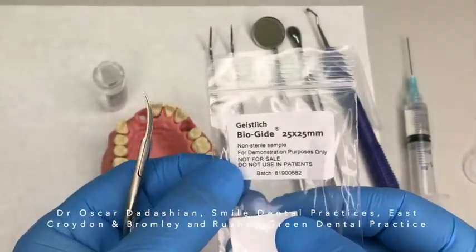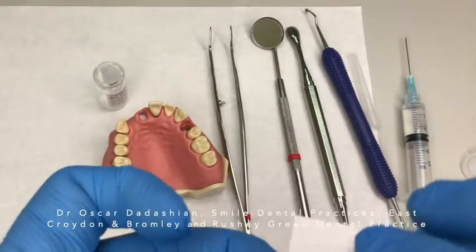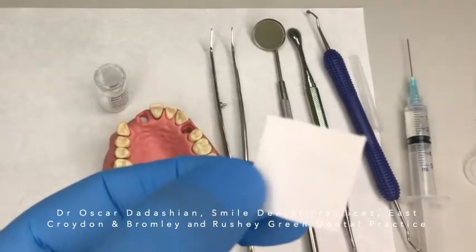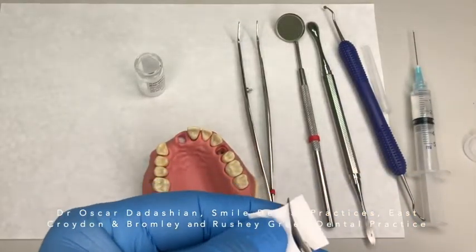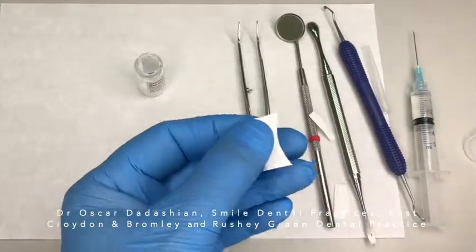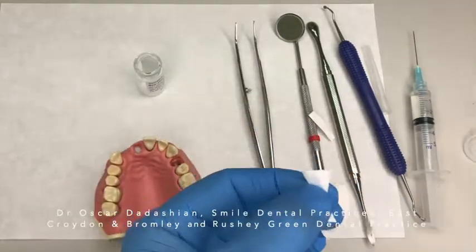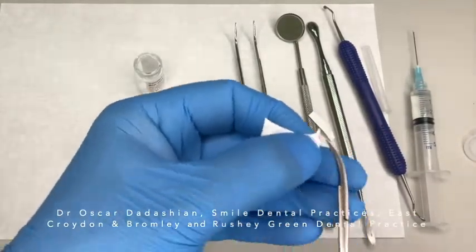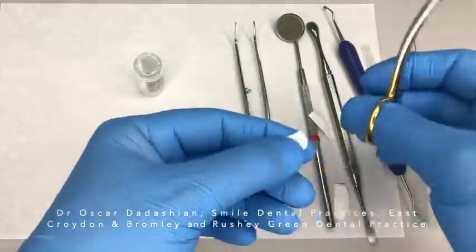Now we are ready to cover our grafting material with a membrane. In this case we are using Geistlich BioGuide. It has two surfaces — a rougher surface and a smoother surface. The rougher surface will go against the bone and the smoother surface will be exposed. It's now time to shape your collagen membrane; I usually make an hourglass shape. Check the shape — if it's a bit too long, make it shorter and make the edges rounder so it's nice and smooth. A curved scissors is normally a lot easier to use.